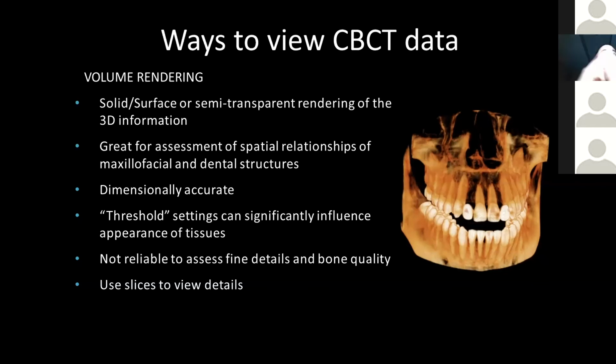And so your software choice really depends on what you need to do with the software. If you're in orthodontics, you need something that has more of the orthodontic tools. The software that I used for this presentation, Anatomage, is fairly expensive. It's several $1,000s at least for the full software package, but it lets you do a number of fancy features: implant planning, having guides fabricated for you, airway analysis, etc. So really, you get in the weeds very quickly based on what you need to do in your practice. Don't be afraid to look at all those details.